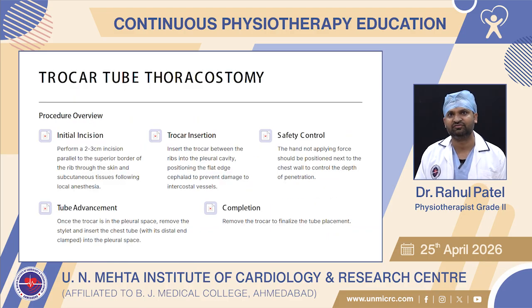Trocar tube thoracostomy. Procedure overview. Initial incision. Perform a 2 to 3 cm incision parallel to the superior border of the rib through the skin and subcutaneous tissue following local anesthesia.